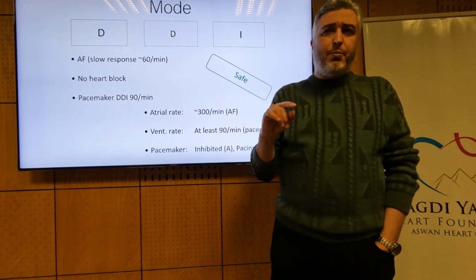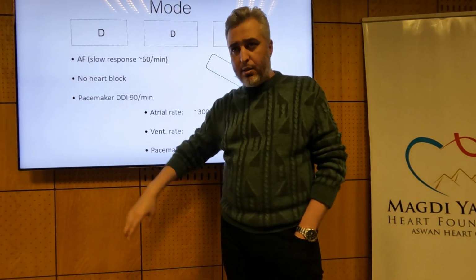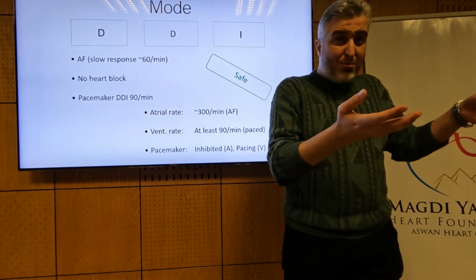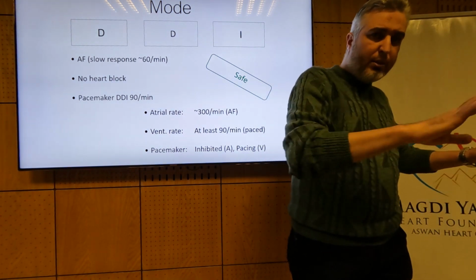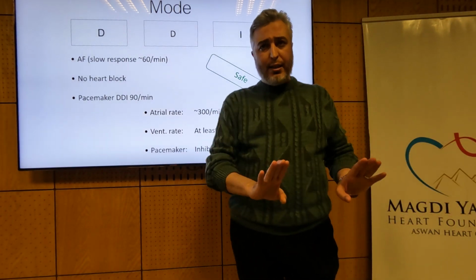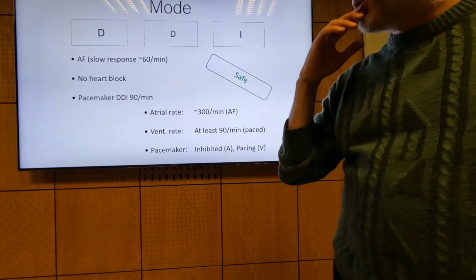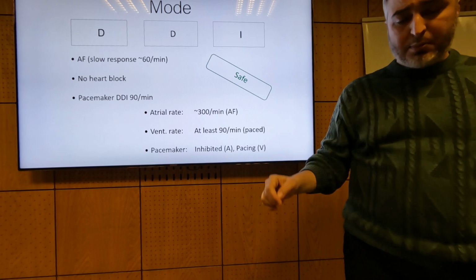Obviously, if the patient goes into a brief episode of AF and you want to revert him back, this is something. Or on the other hand, if the patient has chronic AF, but then after coming off bypass, he's back to sinus, you actually make use of this and slightly pace atrial till you get better cardiac output during that period. But as a general rule of thumb, patients with chronic AF have absolutely no benefit putting atrial wires in the first place. I'm talking about AF. Again, atrial arrhythmia like SVT, you can actually get benefit by overdrive pacing.